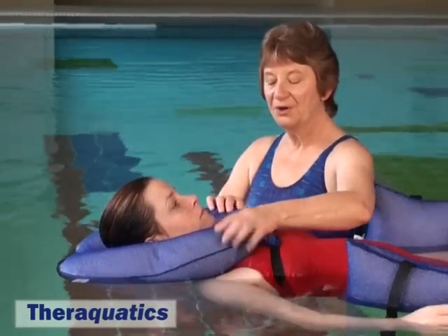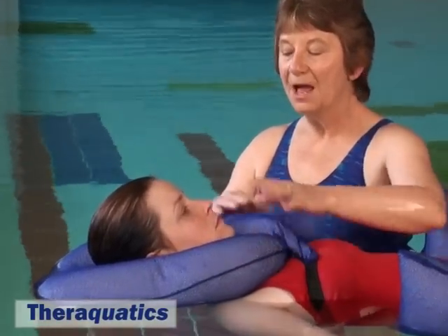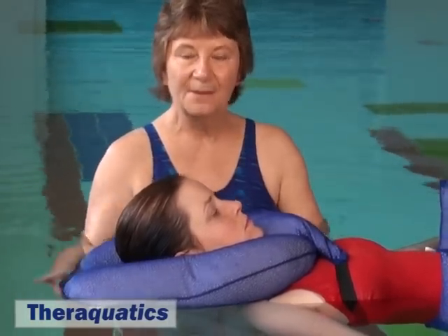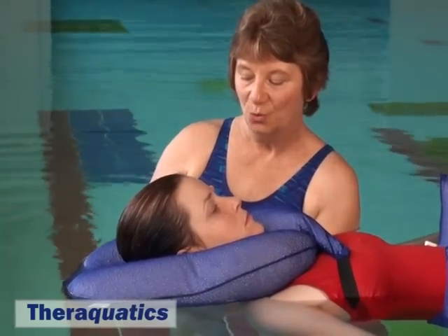The posture pillow does not encroach on the throat and cause any discomfort, but it gives excellent support to the back of the head and the occiput, keeping the ears a little more out of the water but allowing full relaxation of the head and the neck in the water.